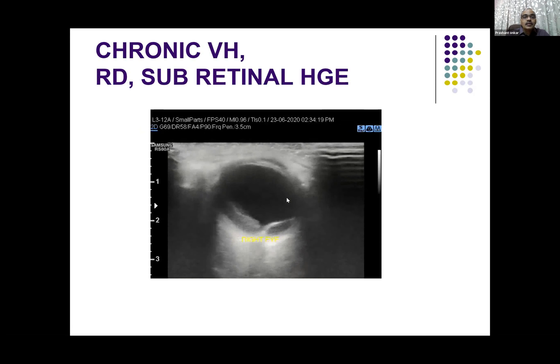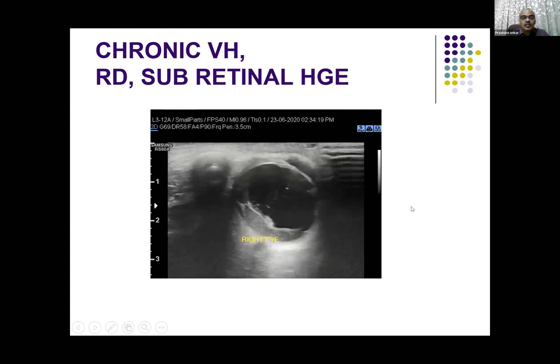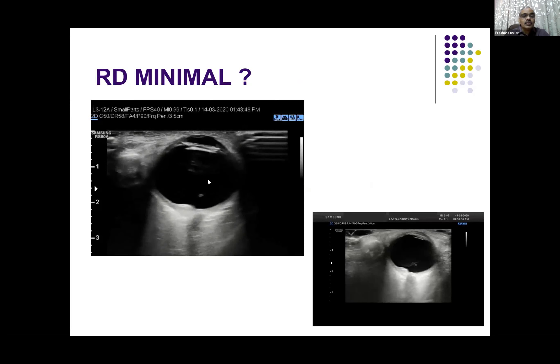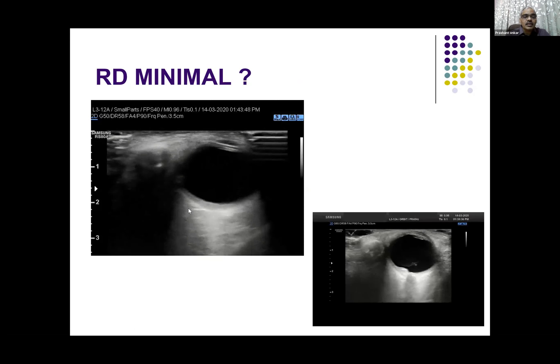Another case — chronic vitreous hemorrhage with complete retinal detachment. You can see hemorrhage posterior to the retina. Identifying the pathologies is very easy, and you can differentiate them. You should have proper settings and you can get the information very easily.